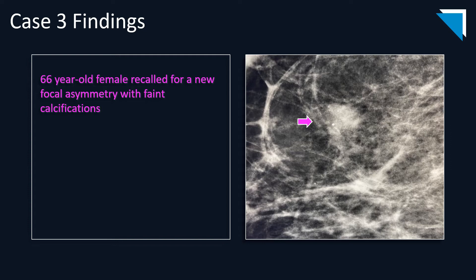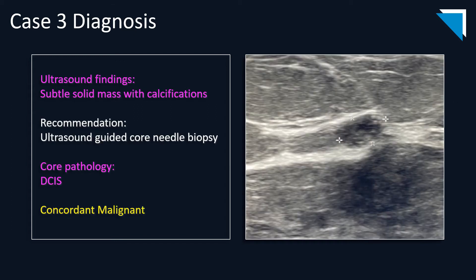Case 3 is a 66-year-old female recalled for a new focal asymmetry with faint calcifications. As you can see on the mammogram image, the calcifications are predominantly faint, but there is one coarse rounded calcification that catches your eye. The asymmetry had very indistinct margins, partially obscured by surrounding breast tissue. Ultrasound findings showed a subtle solid mass with calcifications within — it blends in quite well with the surrounding breast tissue. Luckily, the radiologist recommended ultrasound-guided core needle biopsy of the subtle lesion. Core pathology showed DCIS, and these results are concordant malignant.